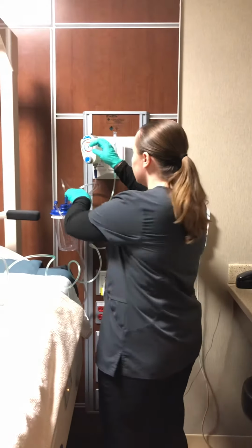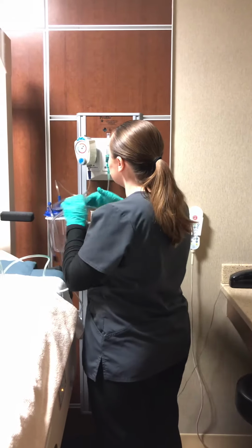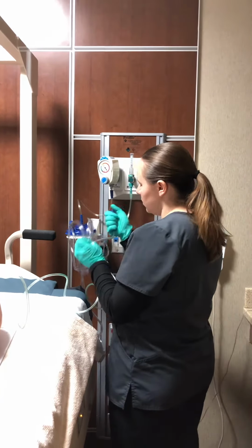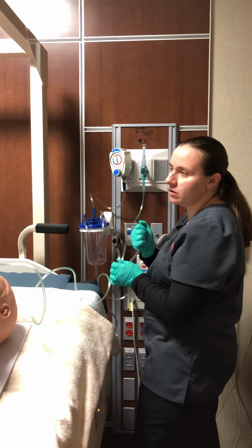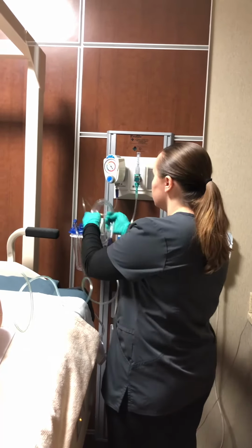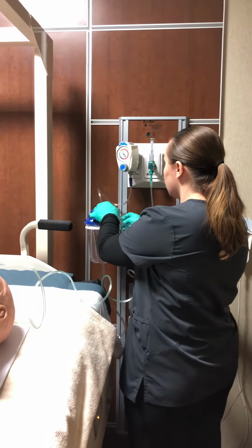And then I will get my suctioning tube ready. I would always connect it to my suctioning vacuum here, and then I would turn it on to regulate. And then I would occlude the opening here, and I want it to be between -120 to -150. And if it's too much, then I can always turn the dial down. That way I know it's on the appropriate setting for the patient.